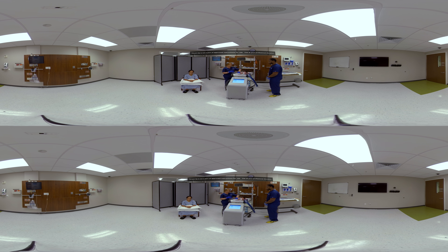If you would like to use positioning devices, you can do so underneath the gel pad around the outside.